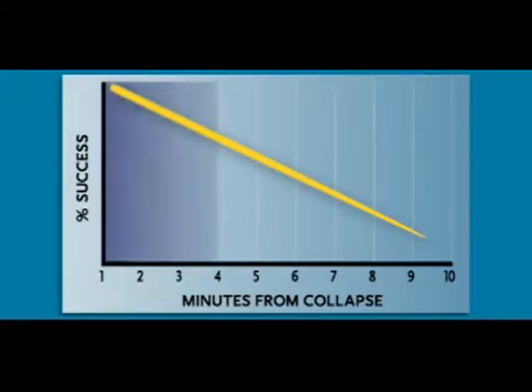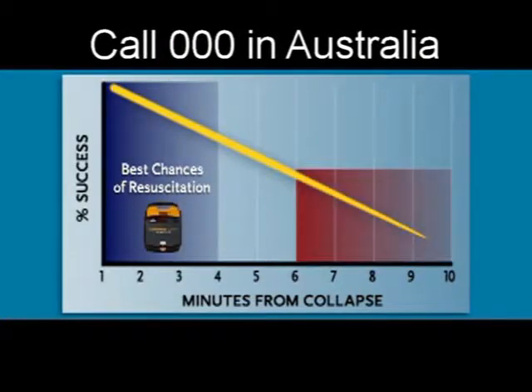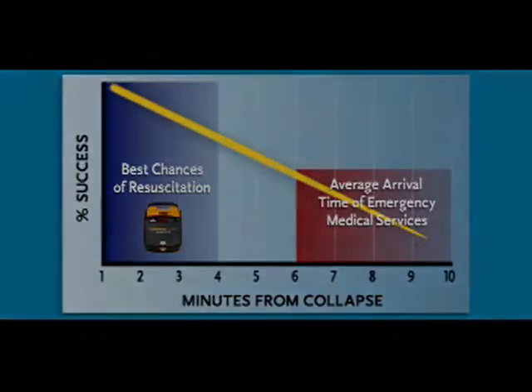That's why CPR and having an AED is so important. When you call 911, the emergency medical team will get there quickly, but it still takes an average of 6 to 12 minutes for them to arrive. But with a Lifepak AED, you can start treatment while the emergency medical team is still on the way. So let's talk about how to do it. First, I'll list the steps, and then we'll go back over them in detail.